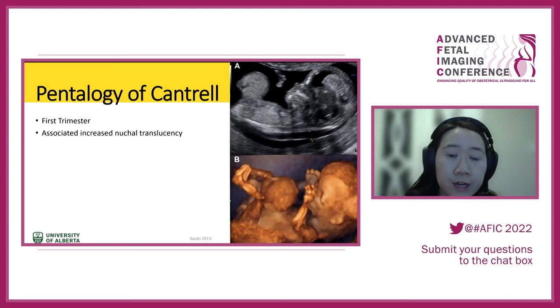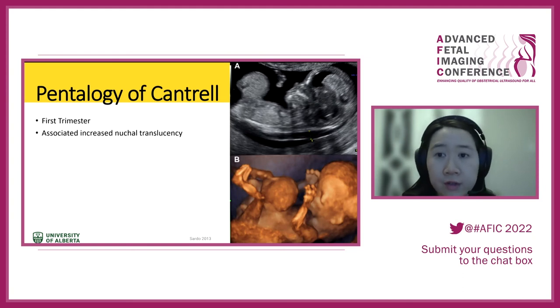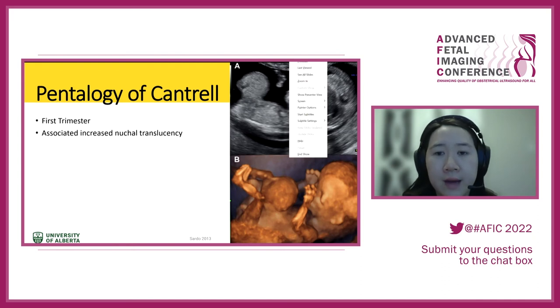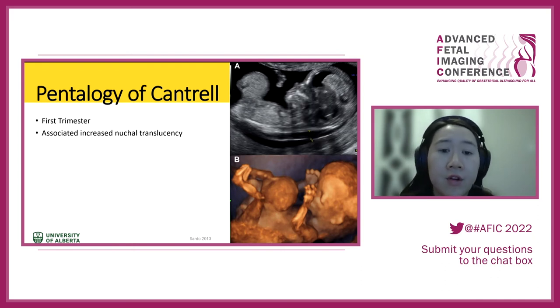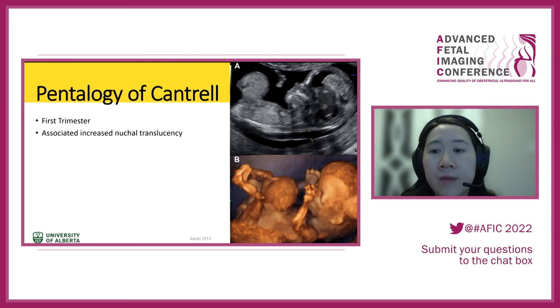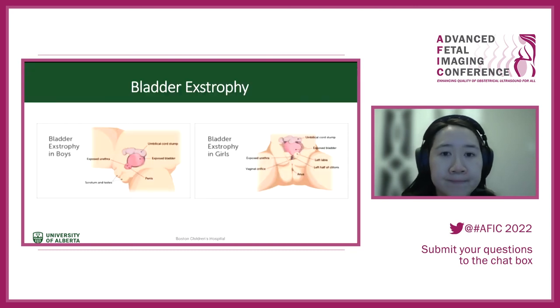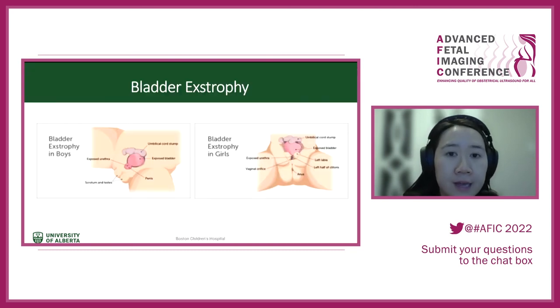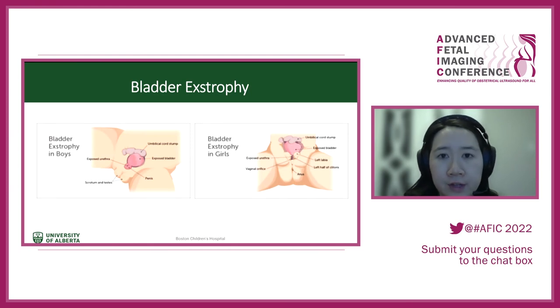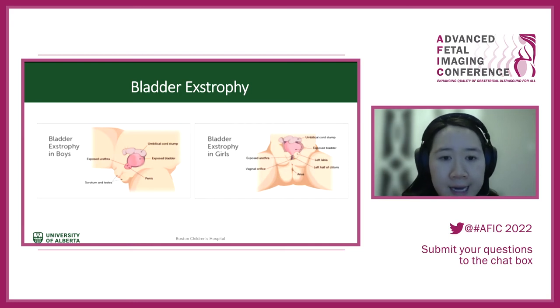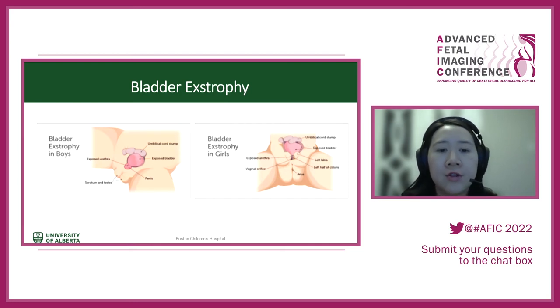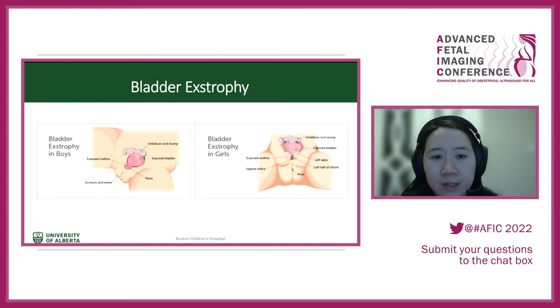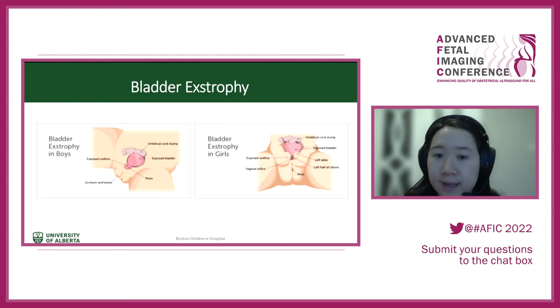In the first trimester, pentalogy can also be associated with increased nuchal translucency. When seeing an omphalocele with increased nuchal translucency, recognize there may be other abnormalities. Bladder exstrophy: in both male and female, essentially imagine your bladder is open to the outside world — that's the gist of what you're looking for.